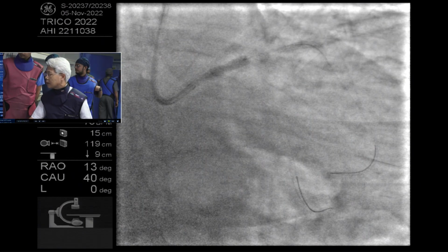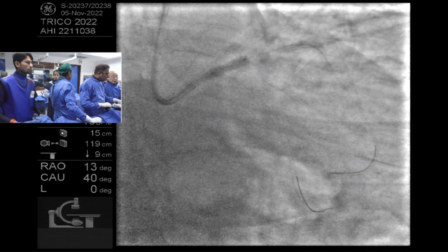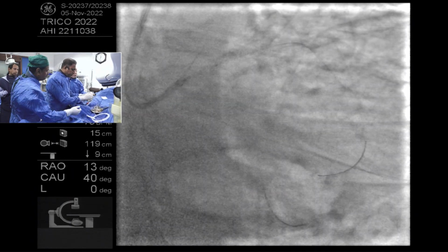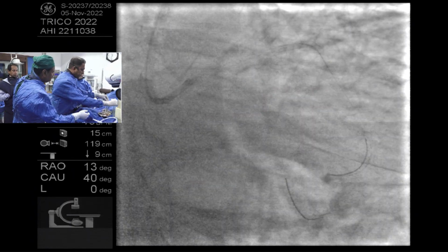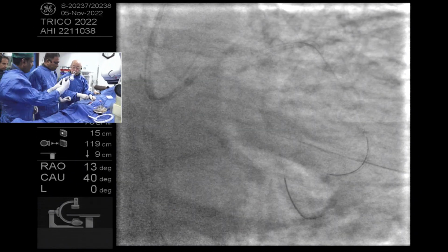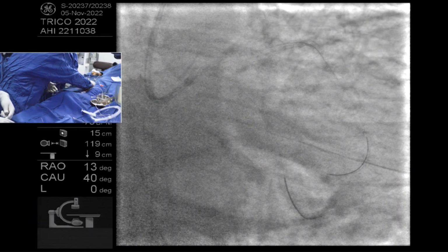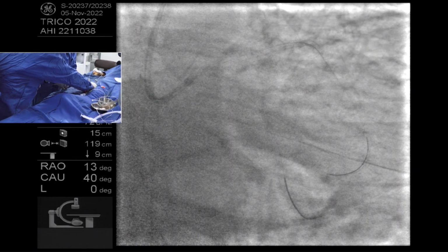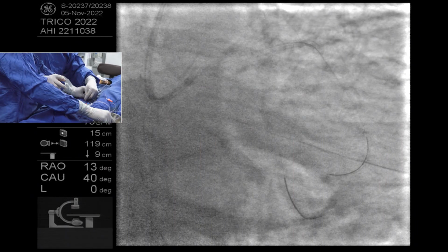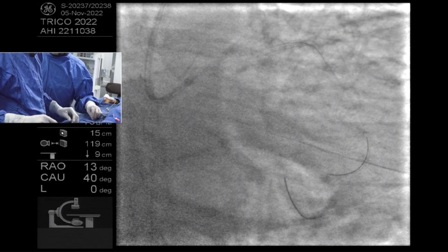And can I have a short high pressure balloon? Which one? 4 size? 4.8? Yeah, 4 or 4.8 NC. Or 4.5. 4.5. 8. Why two short stent for left main? We have no space for POT. Do IVUS? Okay, first I want to check by using IVUS.